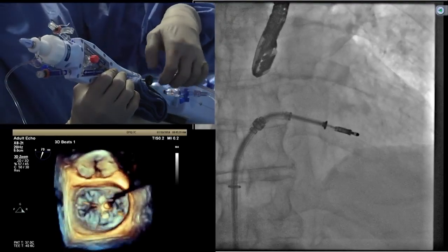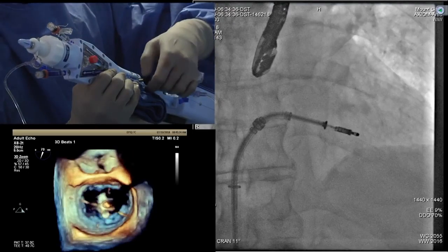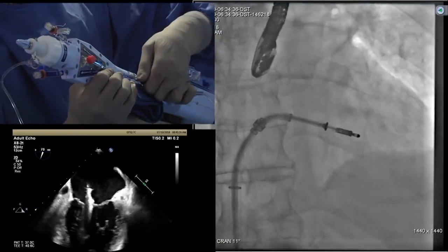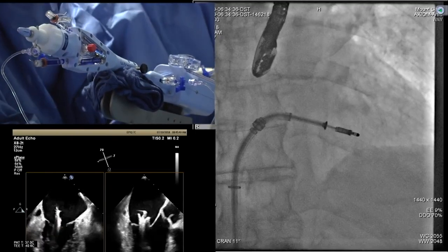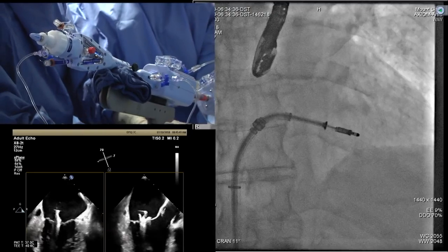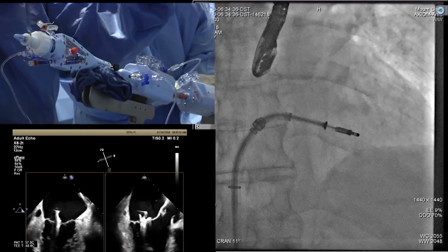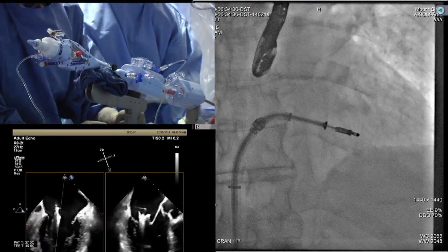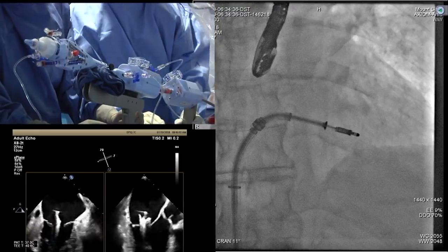The other thing is, once I've done the DC handle movement, you see this black knob that I'm showing? Can you see that? Always tighten it. Otherwise, it'll go back to your original position. So tighten it. So we are looking good there. And on the fluoro, what Gilbert was mentioning, if you see there is no parallax. Essentially, your clip is one line. You don't see the two arms of the clip moving on either way. So it's a nice one line. So we know everything is looking good. Now we move to the LV. The trajectory.